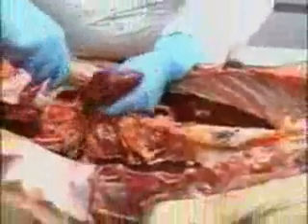Now he's incising the renal capsule, which is a thin membrane that surrounds the kidneys, and he'll strip that back to expose the kidney itself, and then remove the kidney.